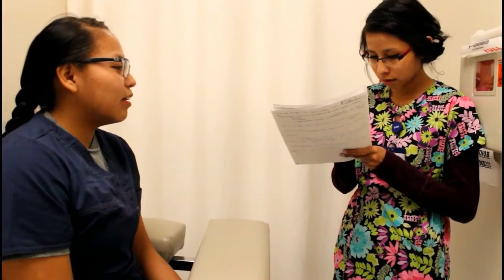Hi, my name is Kristen. I'm from the lab. I will be needing to draw 2 tubes of blood today. Is that okay? Yeah. Okay. Can you verify your name and your date of birth, please? Last name Long. First name Leah. Date of birth 12/26/95. Okay.